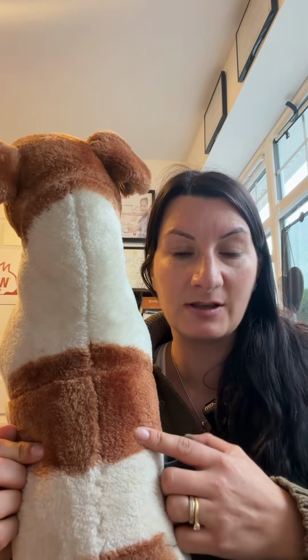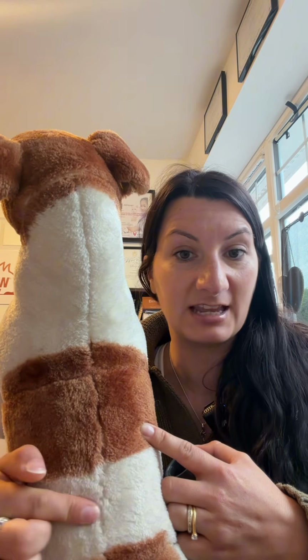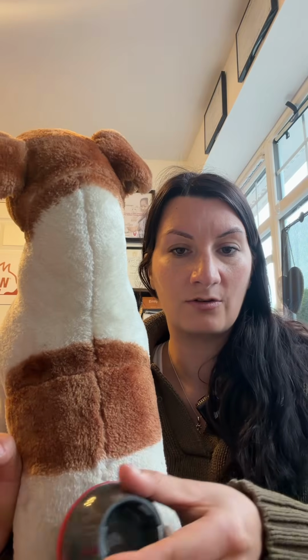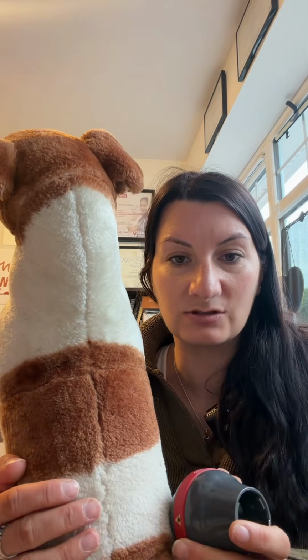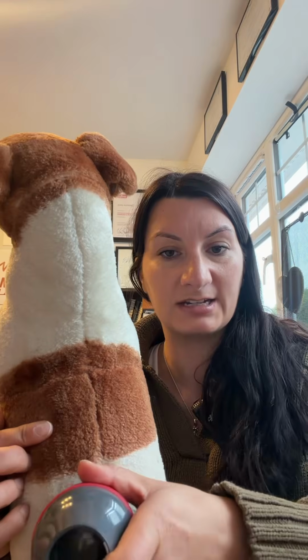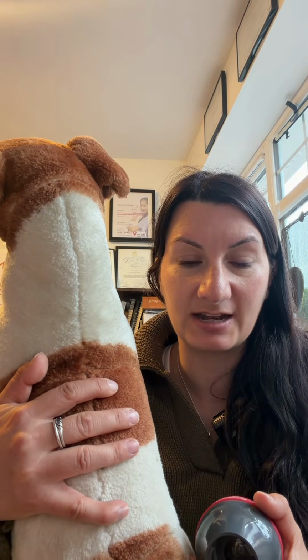We're not going to go up and down the centre of the spine here where we've got our spinous processes. This is going to be really uncomfortable for our patients. What we're going to do is target the epaxial muscles either side and then come through into the intervertebral spaces. So kind of down, cross, up, and then zigzag through. We're not kind of going up and down the epaxials either, because again, we want to make sure that we're spreading our light out evenly as best as we possibly can. So that's how you're going to treat your spinal section.